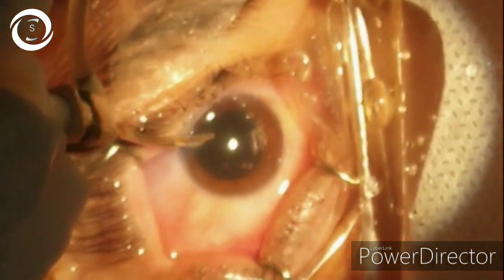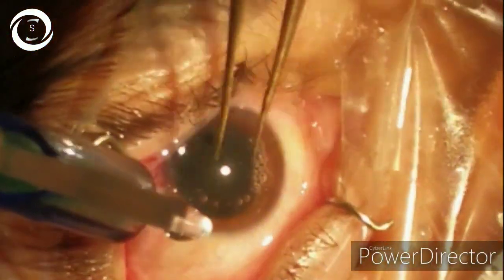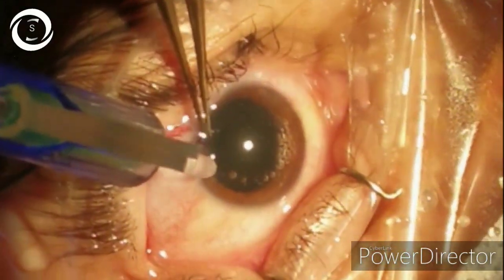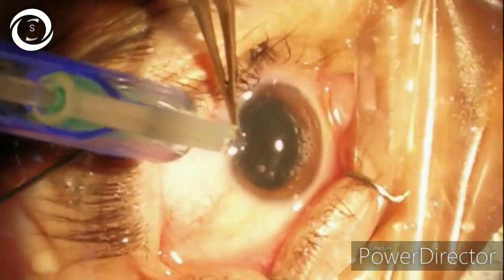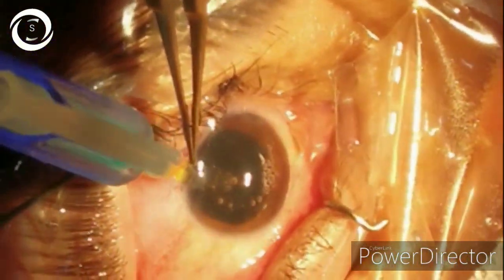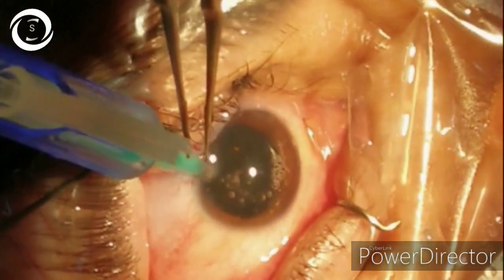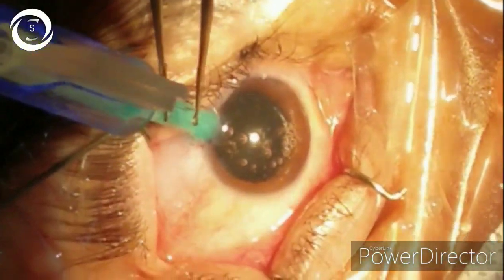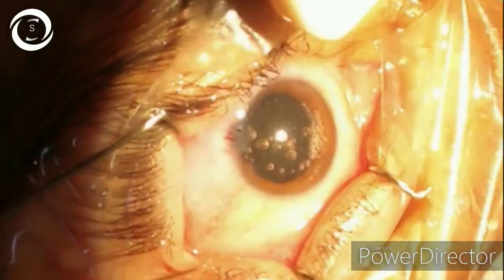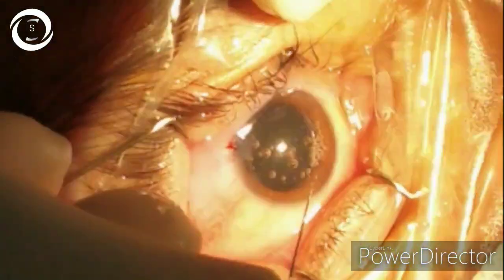Never be in a hurry in such complicated cases. Always do it under topical anesthesia, especially for high myopes, because if you do it under local anesthesia you may perforate the globe and cause retinal detachment. We have now implanted the foldable intraocular lens.